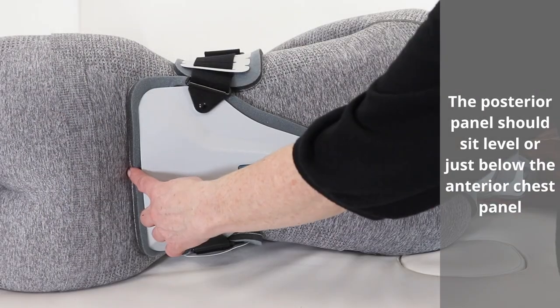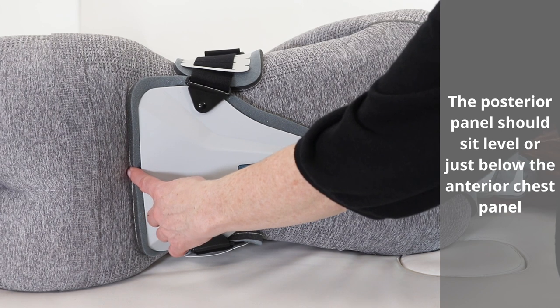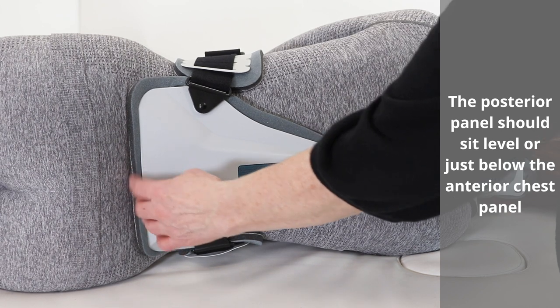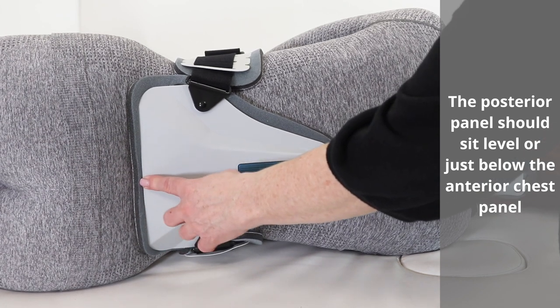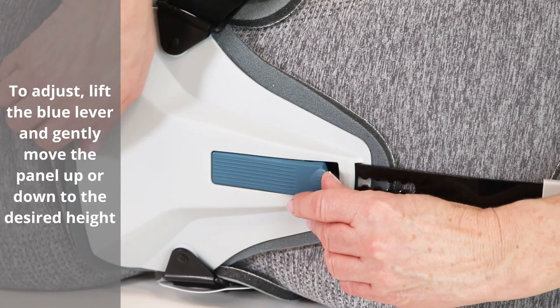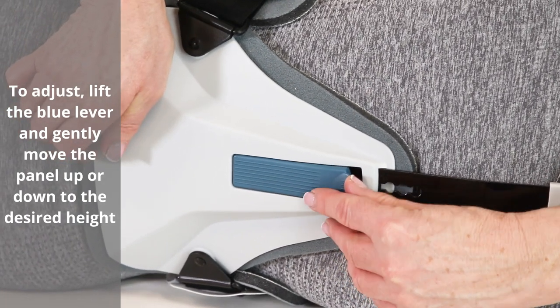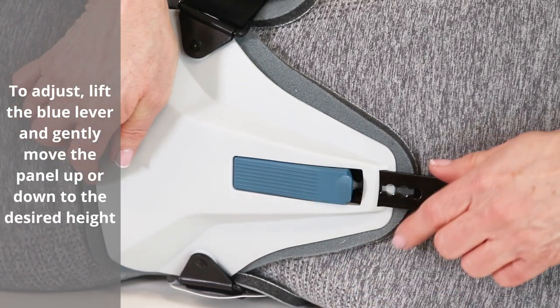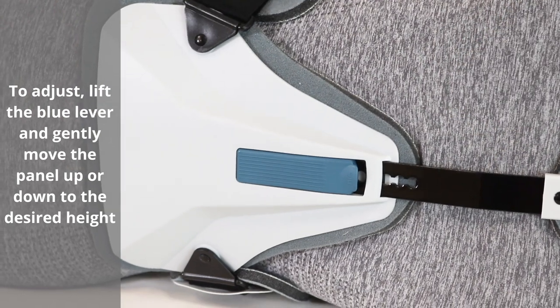The posterior panel should sit level or below the anterior chest panel. To adjust, lift the blue lever and gently move the panel up or down to the desired height.